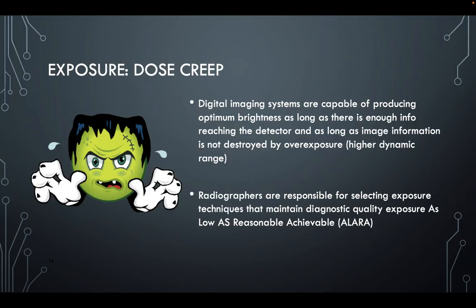And so for a while, this led to techs sending too much technique into the patient and just increasing their techniques so that they always got a usable image. However, this does not follow ALARA. That is exposing your patients to too much X-ray, and it is going to increase the dose to your patient.